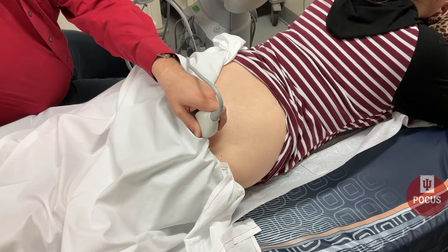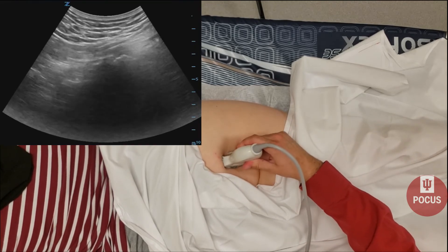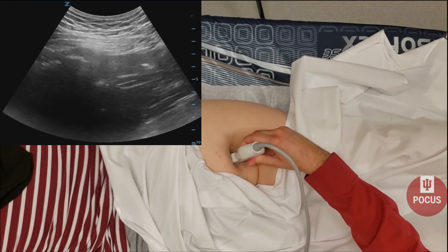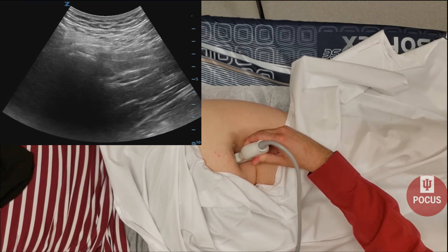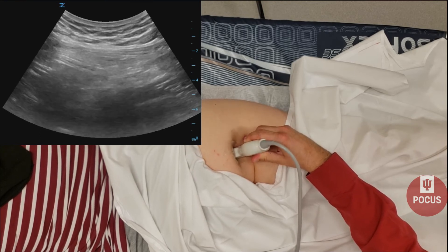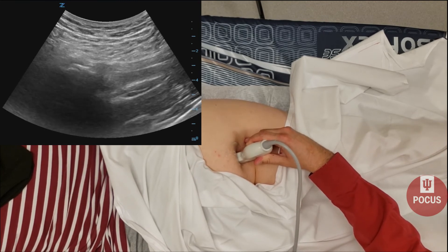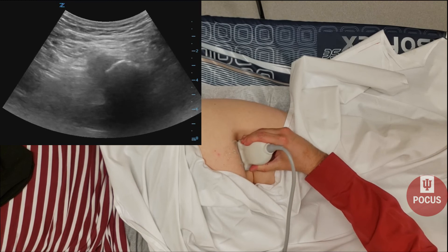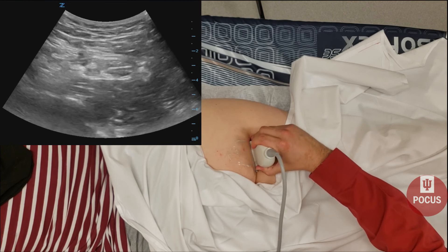We'll look at the ischial tuberosity, where the hamstring tendons originate. You can also approach this from below, finding the ischial tuberosity and hamstring origin again. We can evaluate that in long axis for any signs of hamstring tearing or disruption, then rotate 90 degrees to evaluate the tendons in short axis, looking for any tears or disruptions of the hamstring tendons.